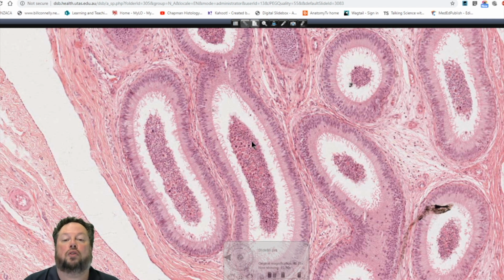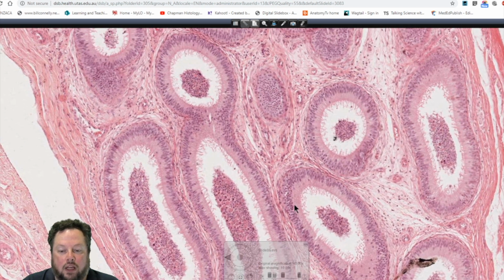And they become more and more concentrated. So whatever testicular fluid's left over after the efferent ductules continues to be reabsorbed here, and the sperm become more and more concentrated. One way to identify a nice section of the head or body region of the epididymis is to look at how regular this epithelium is. Look at that nice round lumen. Very, very regular in height epithelium. Very characteristic of the epididymis there.